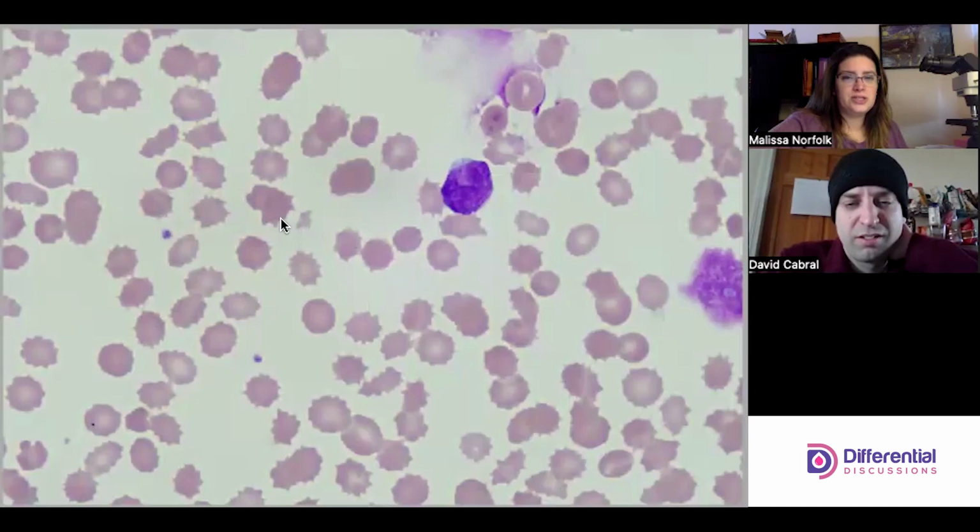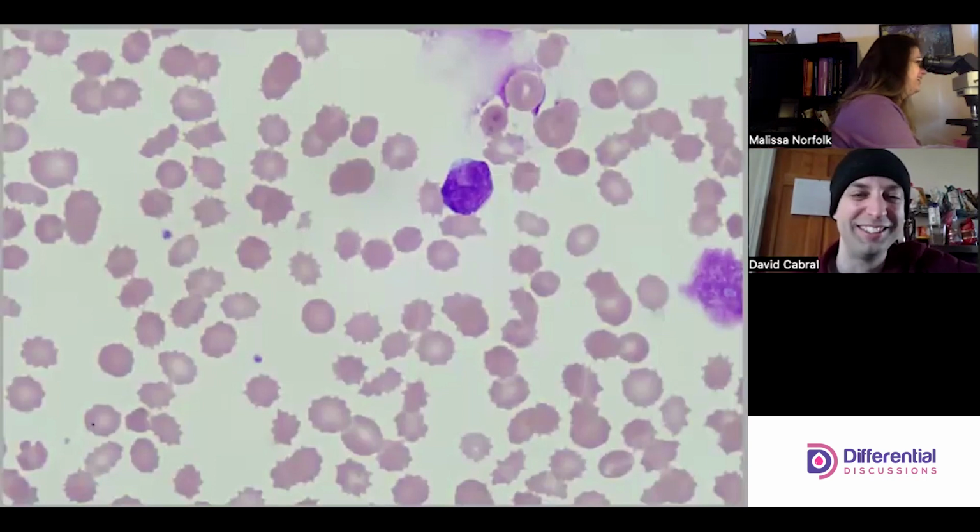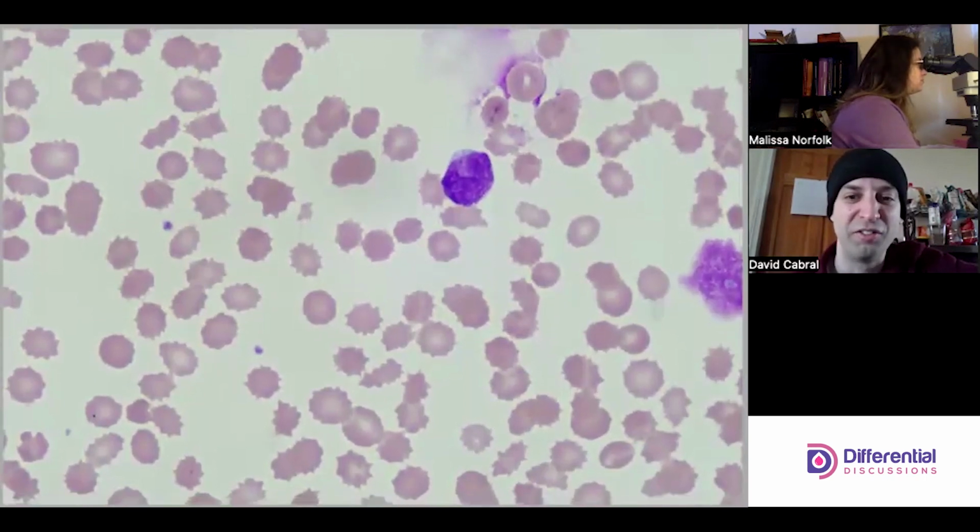And then there is a schistocyte. I've seen a couple of schistocytes, but they've been sort of rare. I think overall it probably doesn't get called in most circumstances. Let me correct myself. It shouldn't get called in most SOPs, but they're rare. They're available.